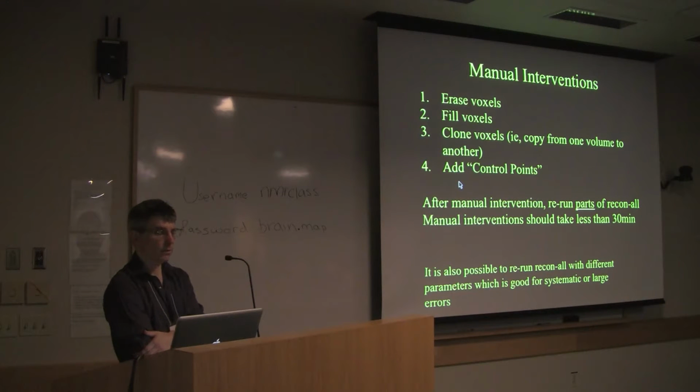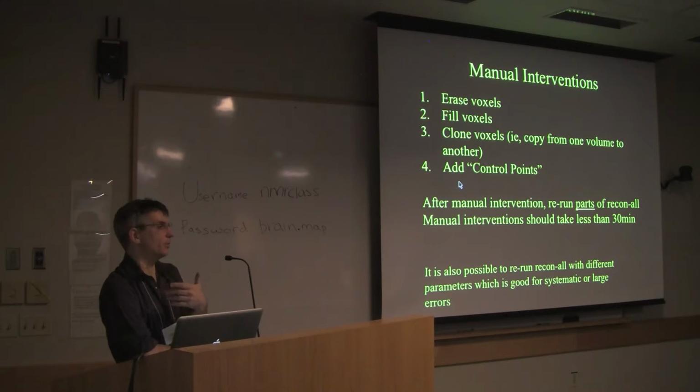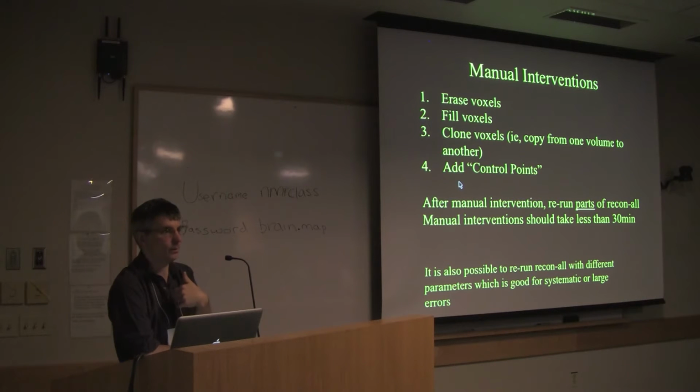And just as a reassurance, this is the reason why we call this the scare talk, because basically you're going to be looking through this volume and looking at where all these surfaces go and whether the surface is accurate or not. And it's not going to be entirely clear whether it's accurate or not. And so you have to get some comfort level, and generally people start in a position of feeling very uncomfortable while they're doing this. So just to give you some reassurance, most of the time when we're doing these types of edits, it takes maybe 30 minutes for a well-trained person to go through the brain, make some changes to the brain, and then just relaunch FreeSurfer.